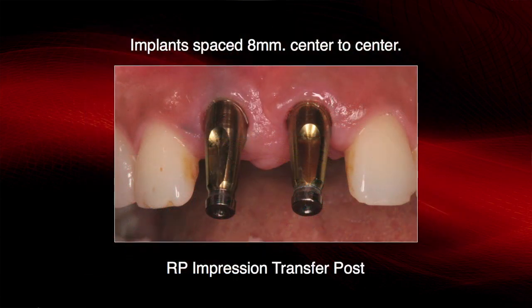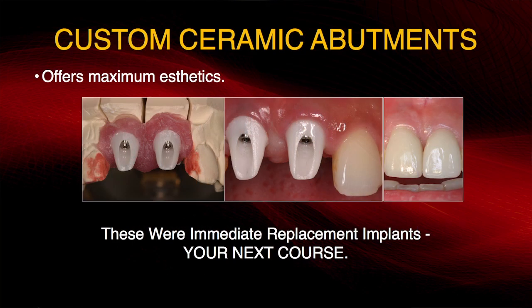So the next case illustrates a custom abutment and keeping the gingival margin in harmony. We see a patient that was in a bicycle accident and fractured numbers 8 and 9. They were unsalvageable, so they were removed and 2 implants were placed. And here you can see at the impression appointment, again, we tried to preserve the soft tissue, keeping the implants away from the facial bone.